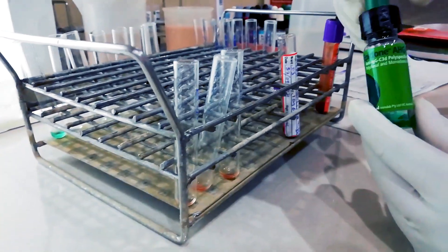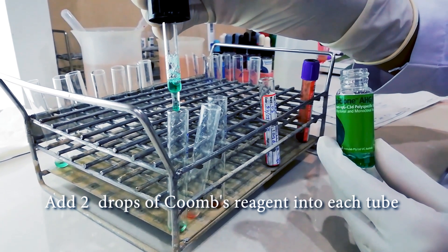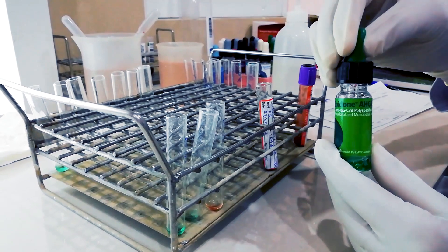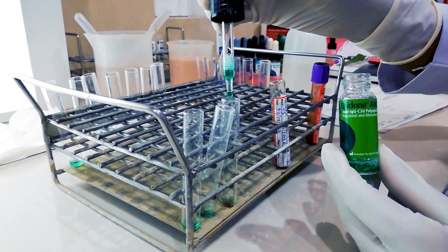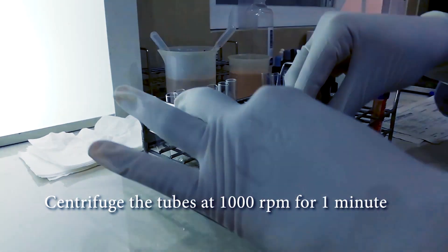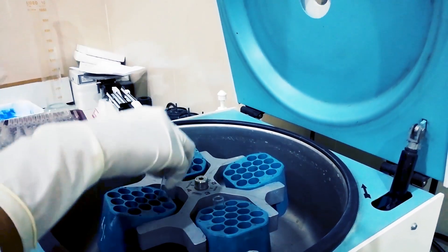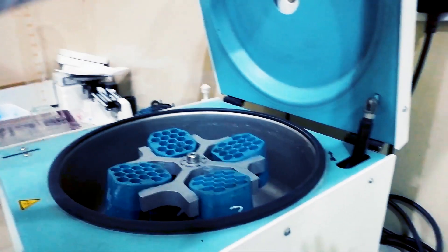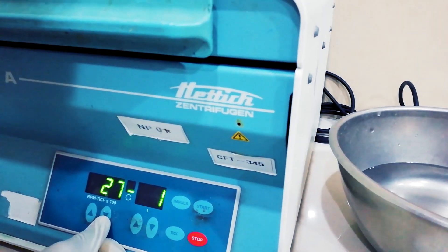After that, we have to add anti-human globulin reagent to each tube. Then we centrifuge at 1000 rpm for 1 minute.